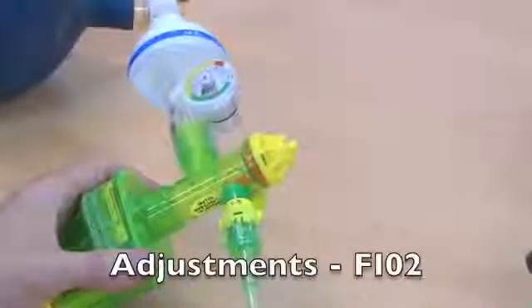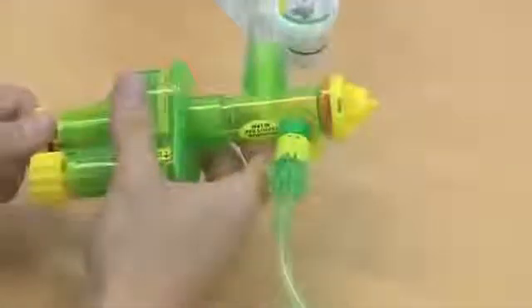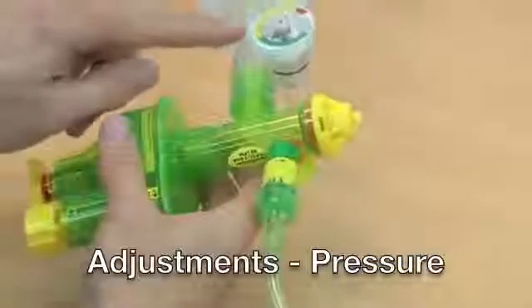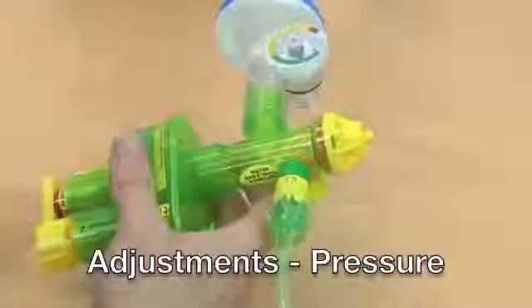There are several adjustments which can be made on the SureVent 2. The FiO2 can be changed between 100% and 65% by adjusting the Venturi sleeve on the base of the Safety T-piece. This can be useful to conserve oxygen and when patients don't need 100% FiO2 to maintain adequate oxygenation. Changing the FiO2 will change other parameters. The peak inspiratory pressure is adjusted by turning the pressure control knob on the modulator. Typically, we would aim to keep the peak inspiratory pressure, or PIP, between 20 and 30 centimetres of water, as indicated by the green and yellow coloured indicator dial.